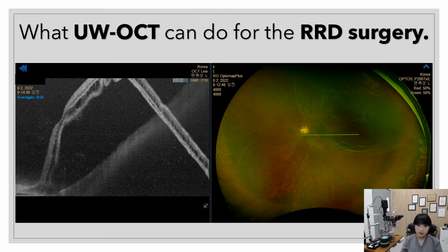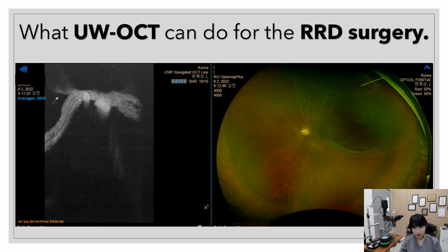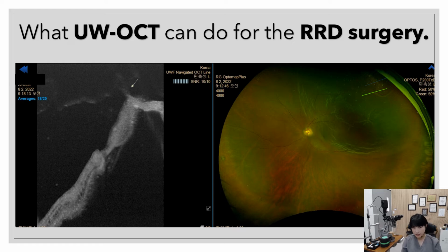An incomplete vitrectomy or any kind of remnant vitreous traction can cause recurrent detachment and PVR. The Silverstone clearly shows images of vitreous traction on the mid-periphery, which should be removed during the vitrectomy. The Silverstone can also reach the far periphery where the retinal breaks exist. We can see the vitreous tractions both anterior and posterior to the retinal breaks.